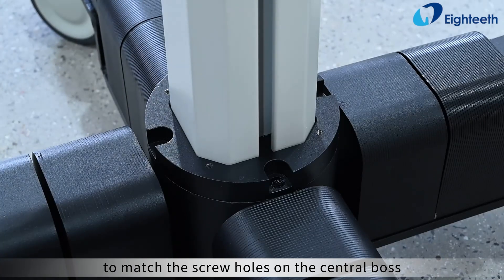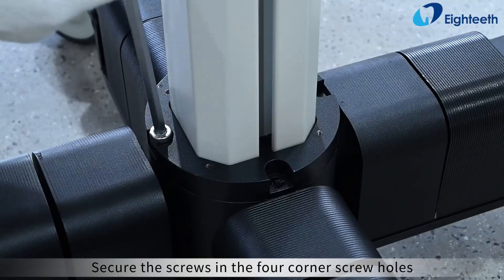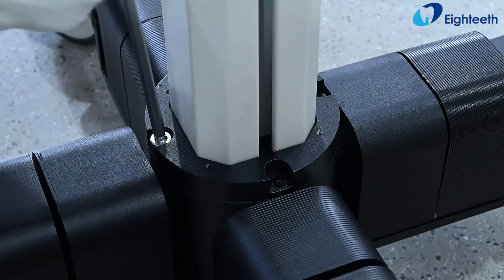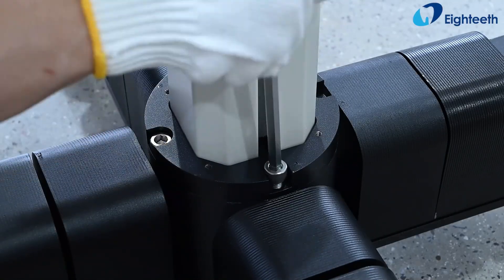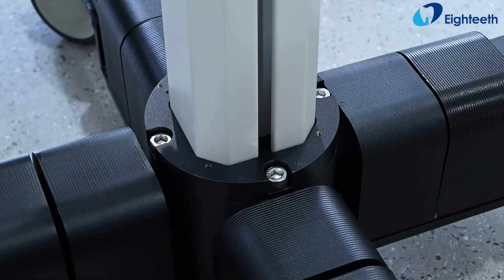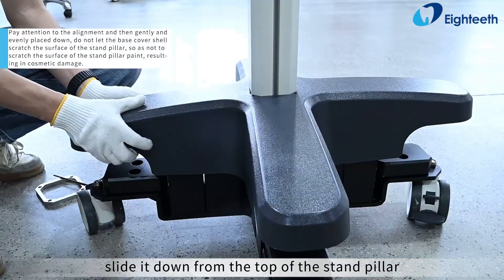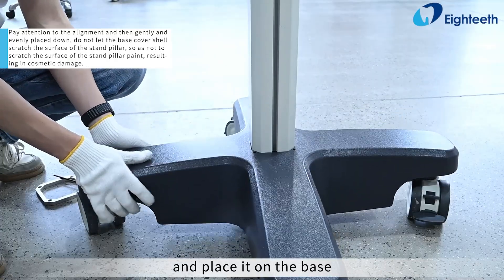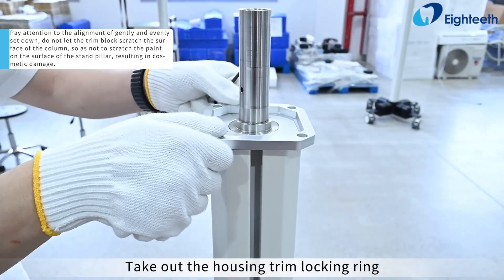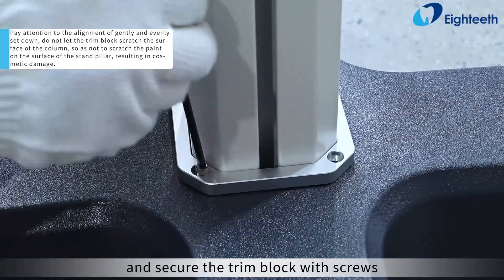Secure the screws in the four corner screw holes. Take out the base cover, slide it down from the top of the stand pillar, and place it on the base. Take out the housing trim locking ring, place it in the same direction on the base, and secure the trim block with screws.